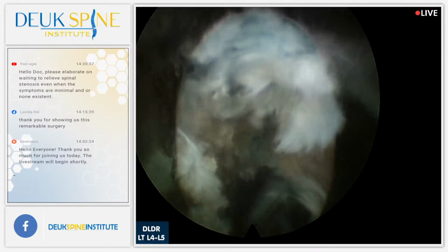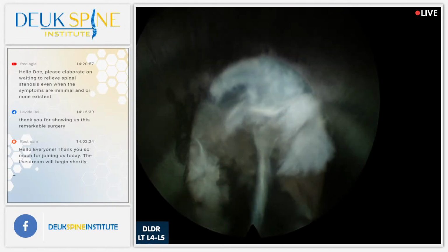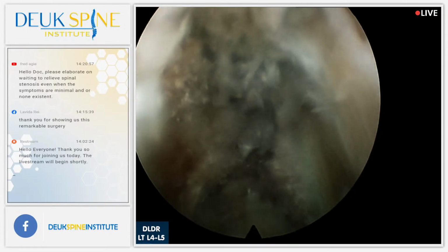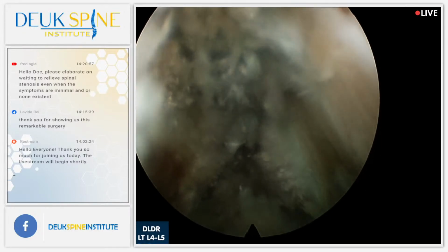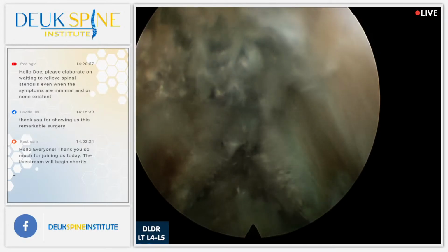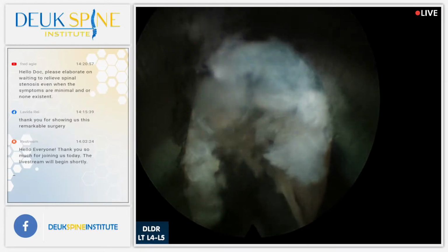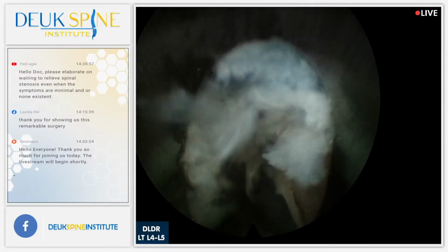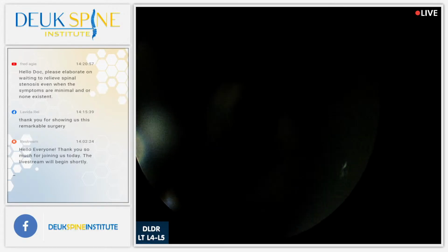What was it, guys? Luis? One of the breakers blew? All right, so let me talk about that. The question is asking... I'm just going to pause for a moment because we're waiting for the laser to come back online. Scope off.